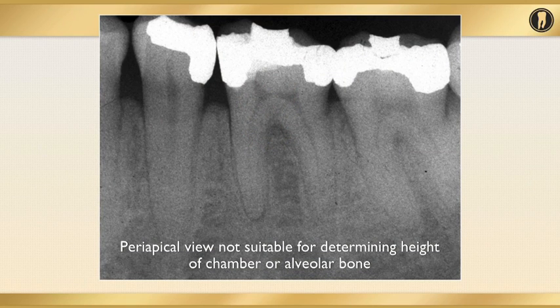When we are doing a pre-operative exam of our teeth, a periapical radiograph is not the best thing to use for measurements and for giving us an idea of the depth and penetration of the impending posterior access.